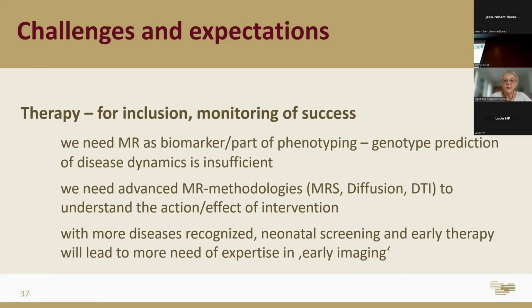And for therapy, it is a little bit similar. We need MR as a biomarker or part of phenotyping, as the genotype alone is not really predicting disease dynamics. In many diseases, it is quite clear. And we need advanced MR methodologies to better understand, in clinical trials, the action and effect of intervention.